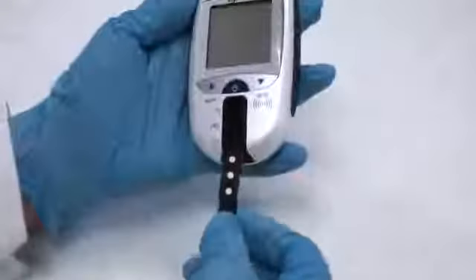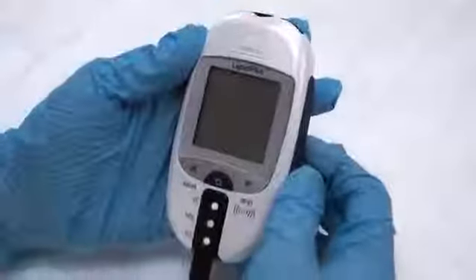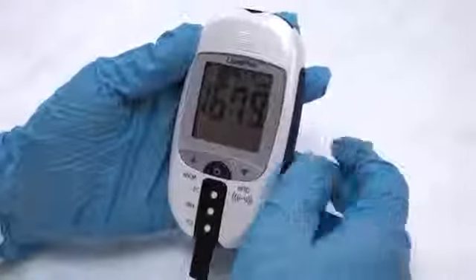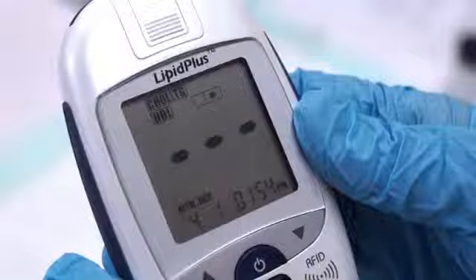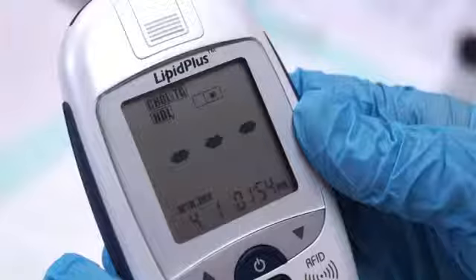To begin testing, insert the cholesterol strip into the analyzer and briefly press the center mode button. The RFID code will appear and should correspond to the code on the bottle. This will then be followed by the testing symbols for cholesterol, HDL, and triglyceride. The blood symbol on the analyzer screen will blink when the analyzer is ready for the blood sample.